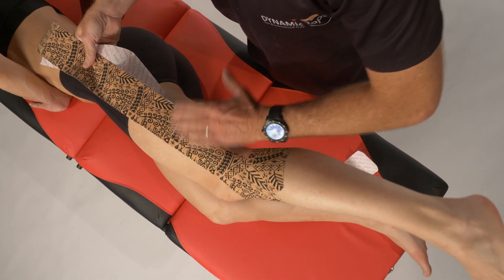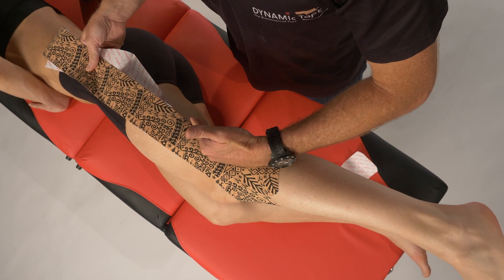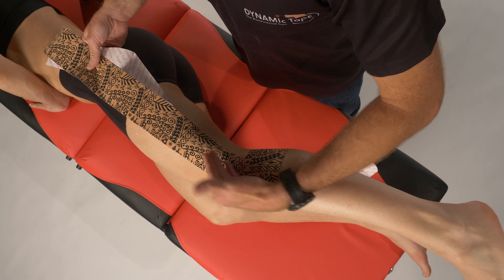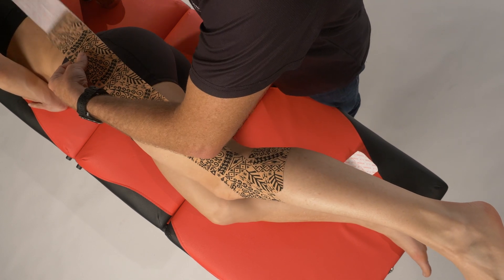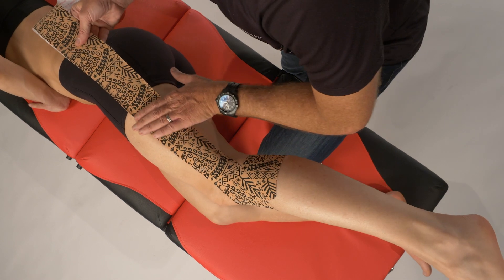We can even go a little posteriorly with a little knee flexion if we do think that the biceps femoris is overactive. So we can add a little knee flexion moment in there to reduce the activity of that overactive biceps.